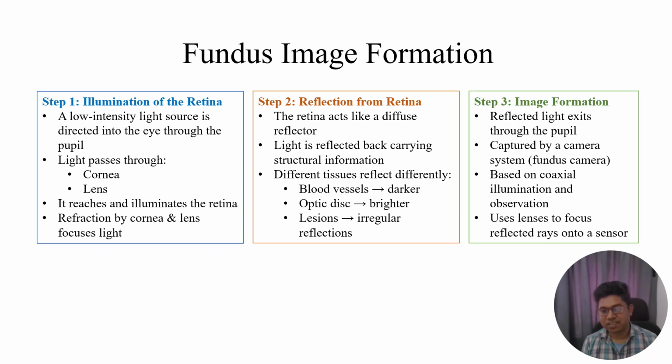And then finally this reflected light helps in the image formation, which is captured by this camera system or optics, which is also called the fundus camera. Based on this coaxial illumination and observation, the image is analyzed, and there are lenses which focus this reflected ray onto the sensor of your fundus camera.